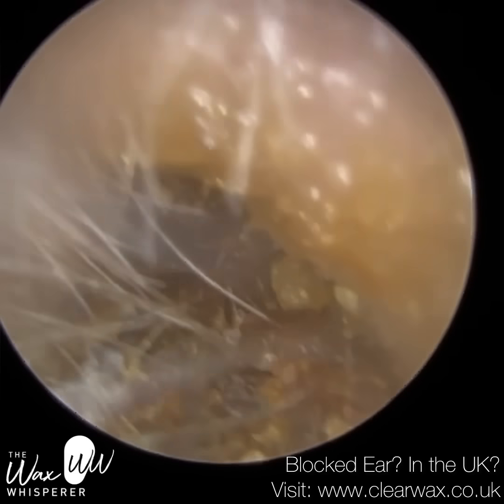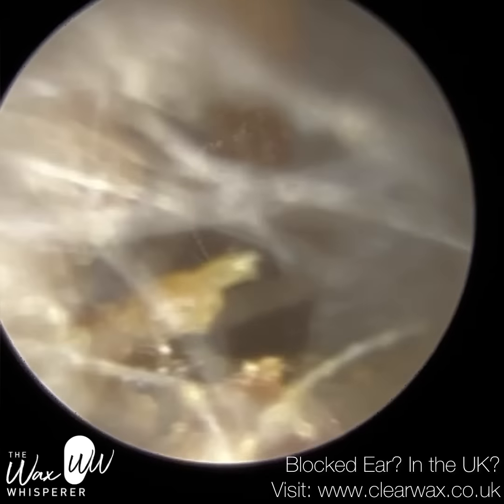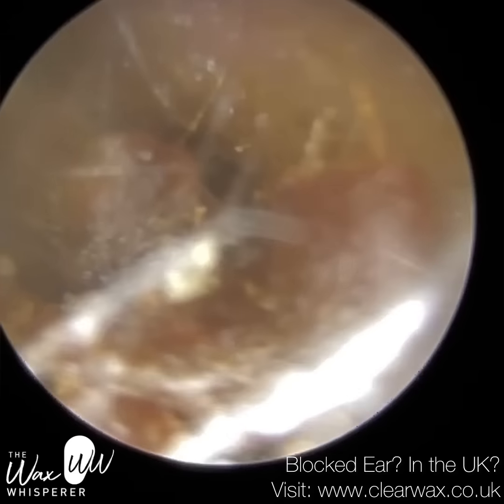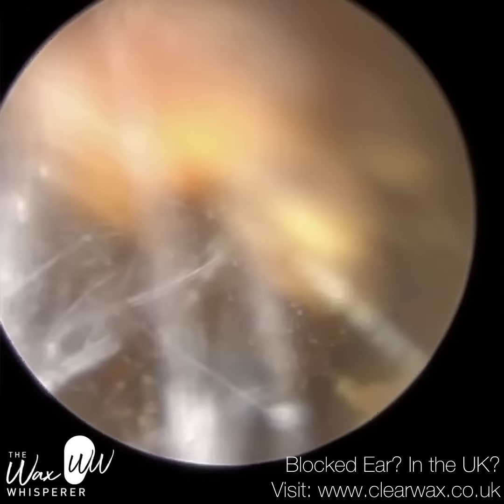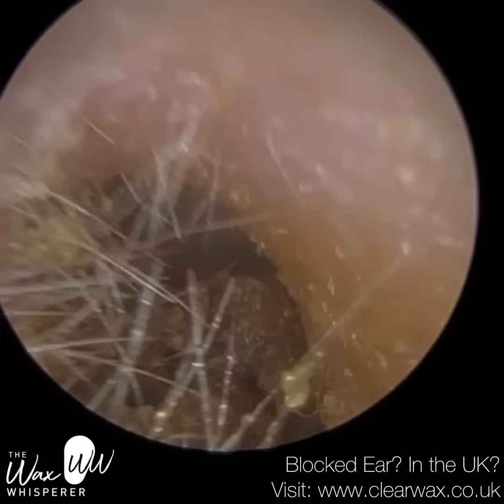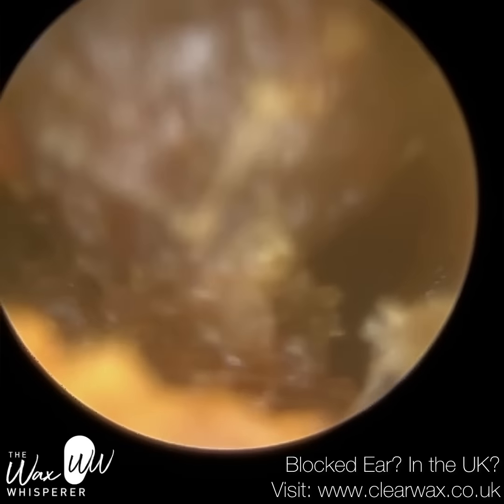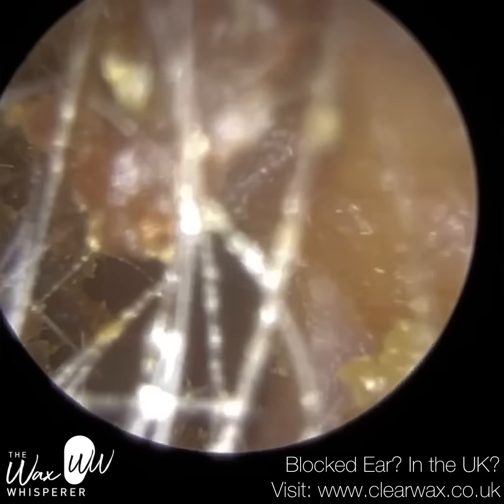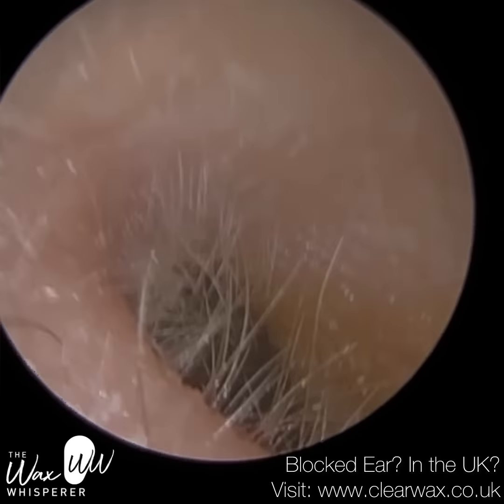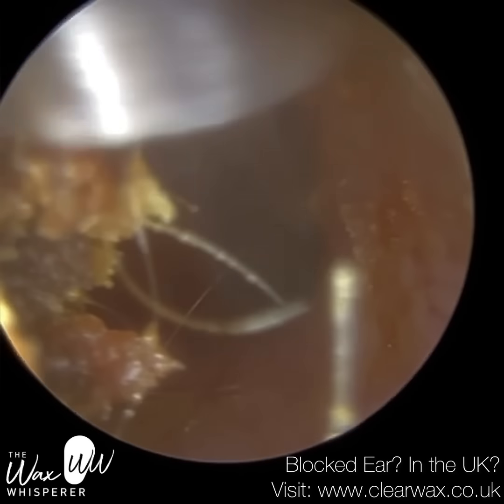So it's just this bit here. I've managed to coagulate it together so it's in one piece, and it's just trapped at the entrance — we're at the location of the first bend, just where all the hair strands are. You can see them protruding outwards. These hairs generally protrude slightly towards the entrance, and the rationale behind it is it almost creates a one-way barrier for wax to migrate out, and also helps to stop invaders — insects etc. — from entering.